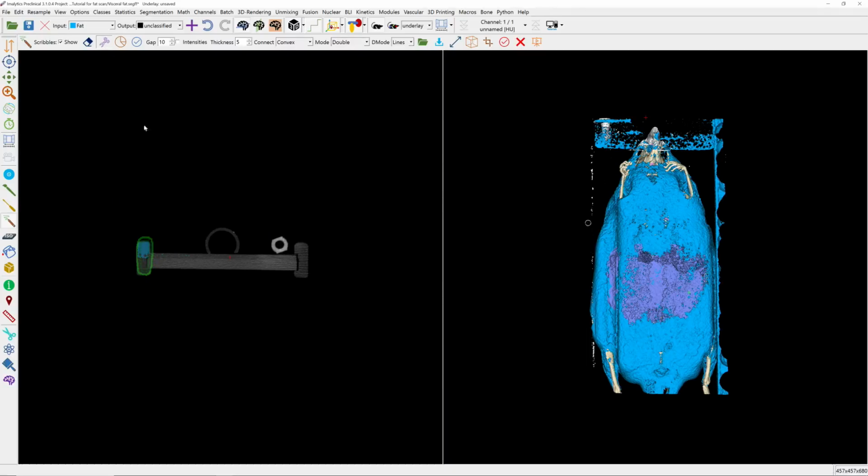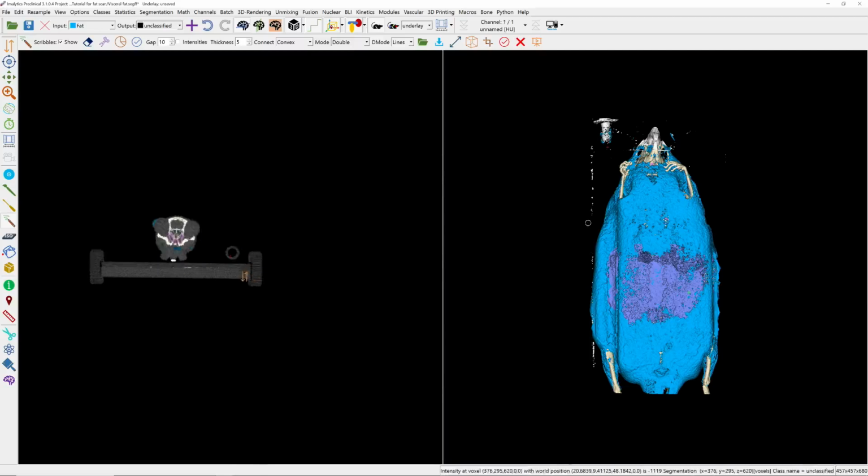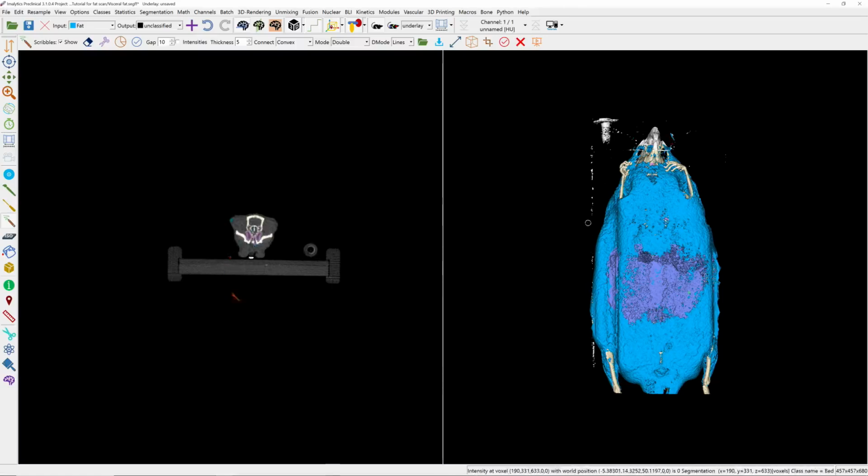Okay. Now that one is removed, and we can do the same here for the parts of the bed. So you can just draw the edges here, that's enough. Until here. Scissor. Okay, then we have also something here. Oh, that looks good. Let's get rid of that tiny part here.